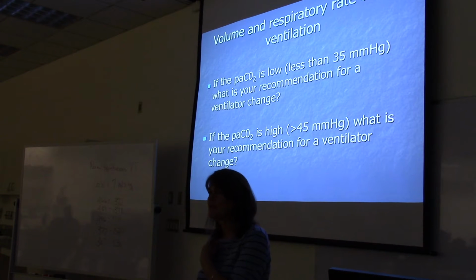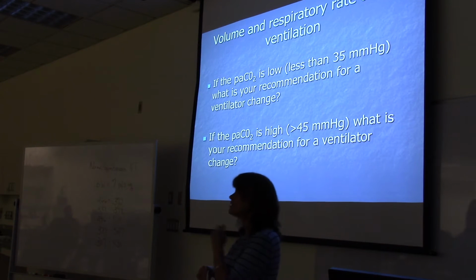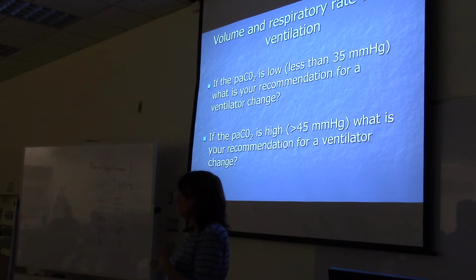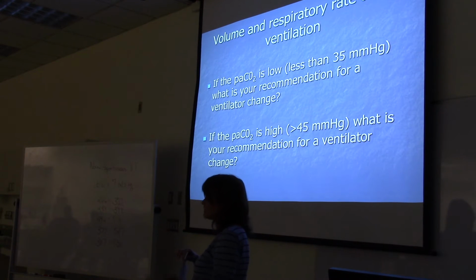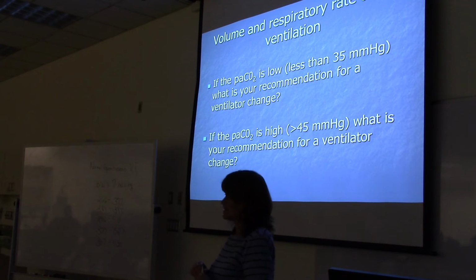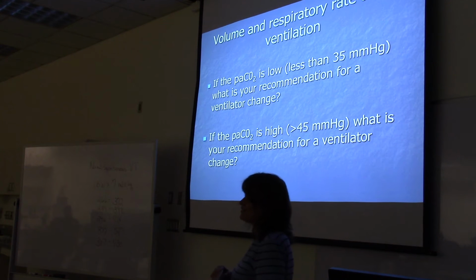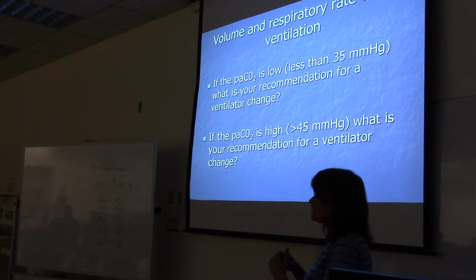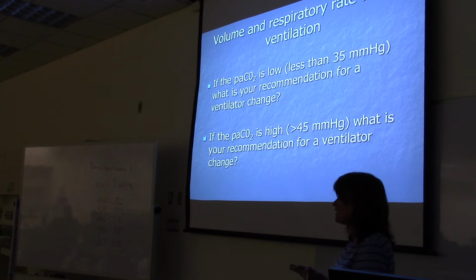Increase the respiratory rate? No, decrease. Yes. Decrease the respiratory rate, and that'll allow the CO2 to stay in the blood and not be exhaled. And then the CO2 level will come back into normal range. Because if you increase it, then it goes even lower. Very good. That's the connection I want you to have. So less ventilation, CO2 will climb. More ventilation, CO2 will drop.